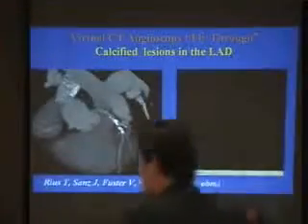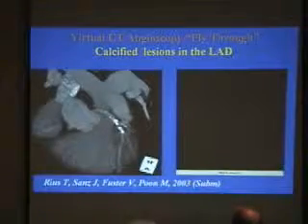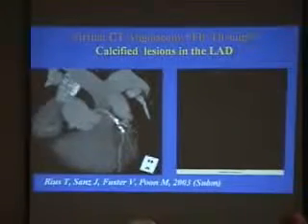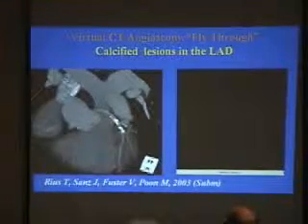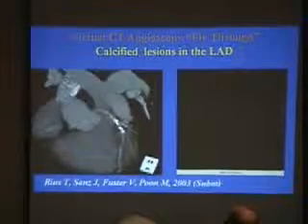You have a patient at a high risk, you have a high risk score, and the next question is, does this patient have coronary stenosis, and you are in trouble. Because the calcium overshadows the artery. You do not see anything there in terms of the narrowing. This is like when you go to catch an airplane and you carry your computer. They tell you, take the computer out. Sure, you have to take it out. Otherwise, the people cannot see what is behind the computer. This is what happens with calcium.